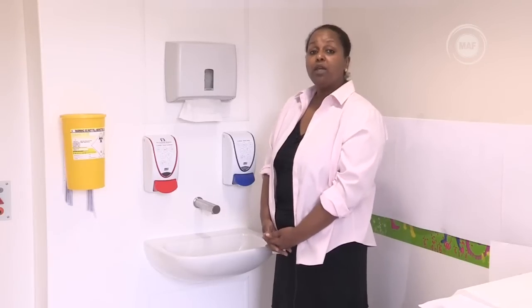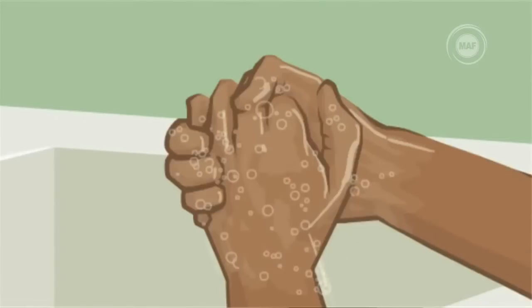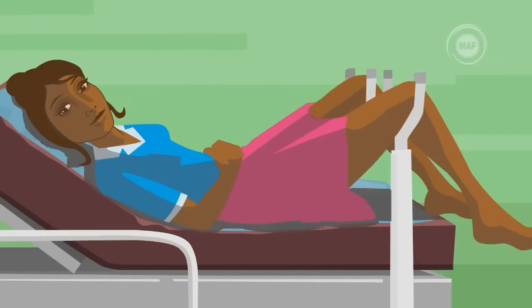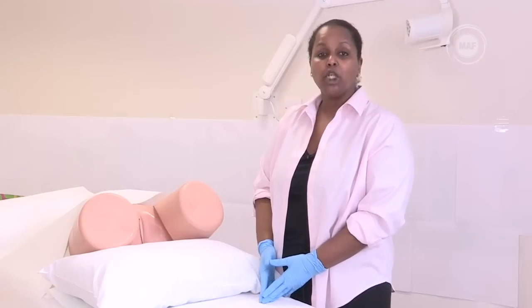Once you have the equipment and examination room ready, you can have the woman get into position while you wash your hands and put on your gloves. The woman will need to lie on an examination table or bed in the lithotomy position with her legs open and her knees supported. If leg supports are not available, a chair can be used to support her legs by putting her feet on the edge of the chair.